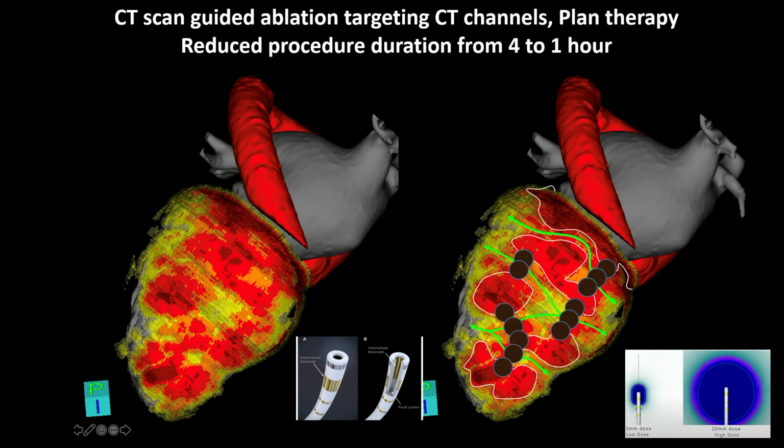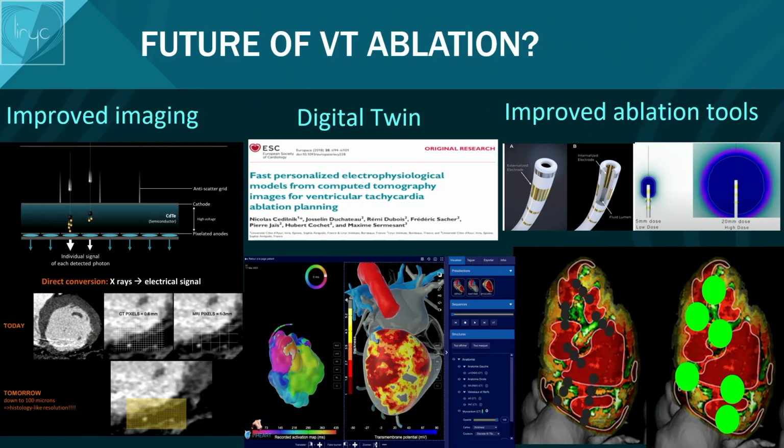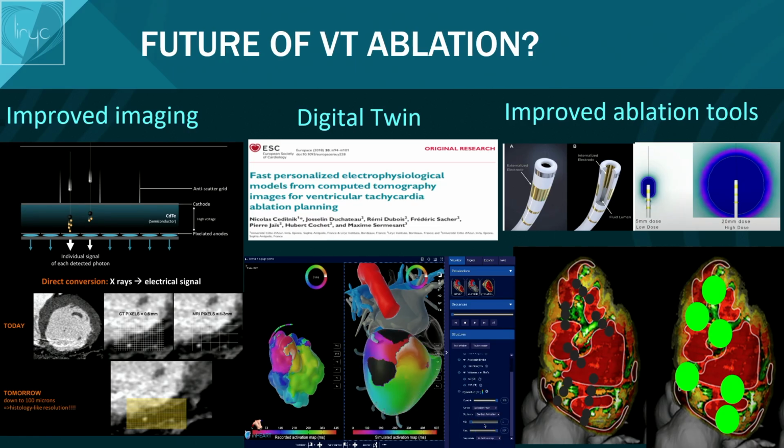So we'll make this ablation with one spot only, with no risk for absence of coalescence of the lesions, and superior outcomes as compared to what we have at the present time. And we also have the benefit of improving imaging by photon counting or our superior MR sequences. And you can run out of these images some simulation in the computer that show you the predicted VT circuit. This is the animation here, and here the circuit starts. It matches very well what we observed in this patient. So this is the future, and I thank you so much for your attention.